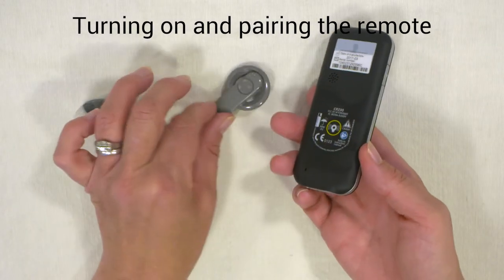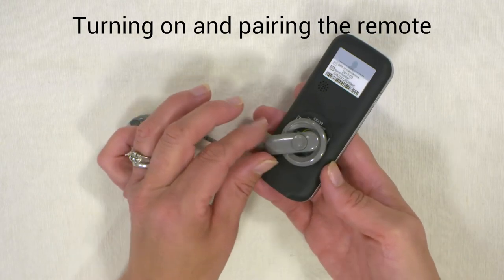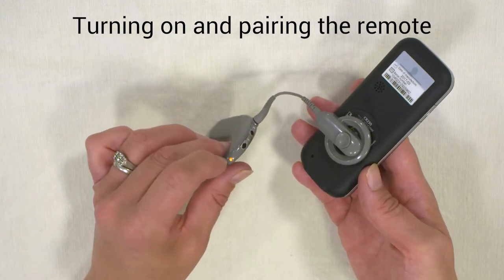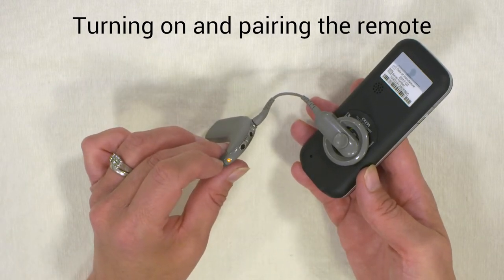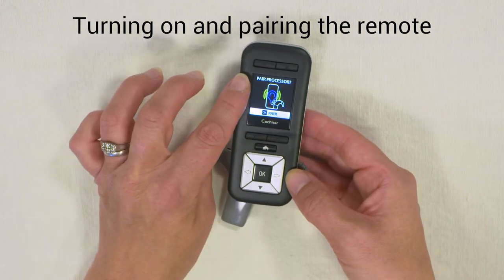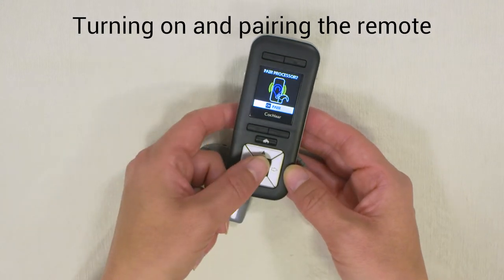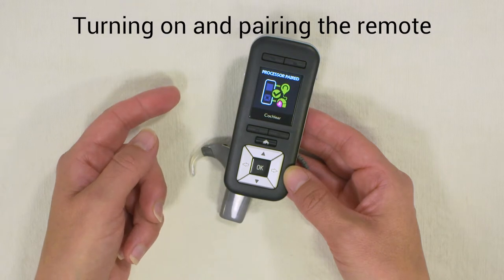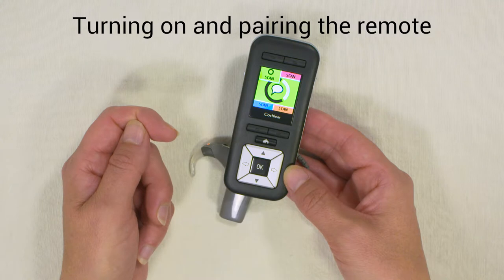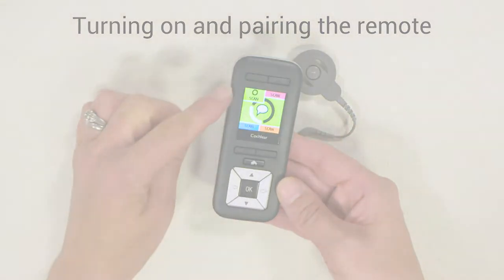To pair, take the coil and attach it to the back of the remote. Make sure the processor is switched on — you should have a flashing light on the processor. The screen comes up asking you to pair the processor. Press OK, it pairs and comes up with a tick, and now you have the programs that have been set for this processor.